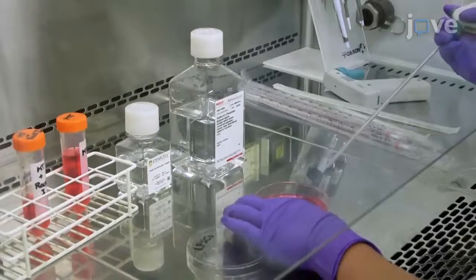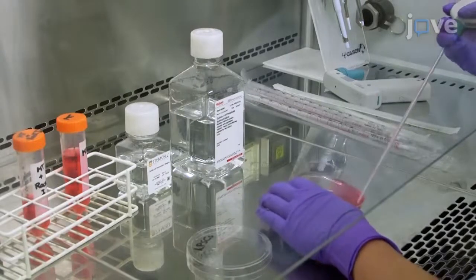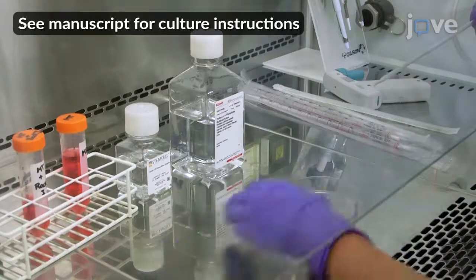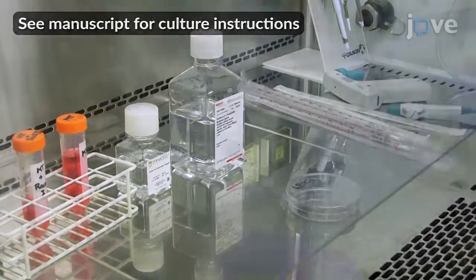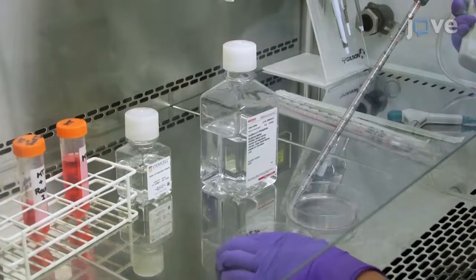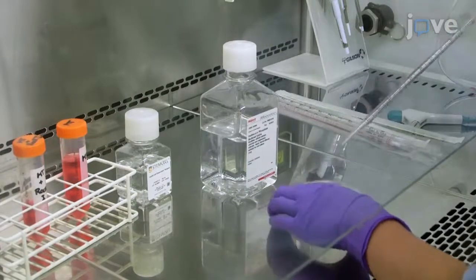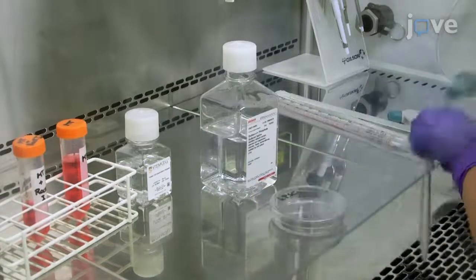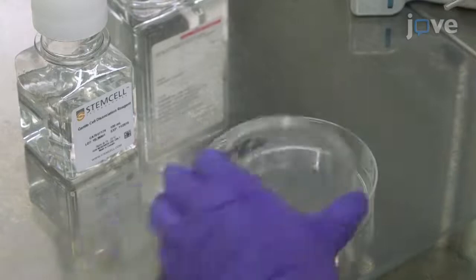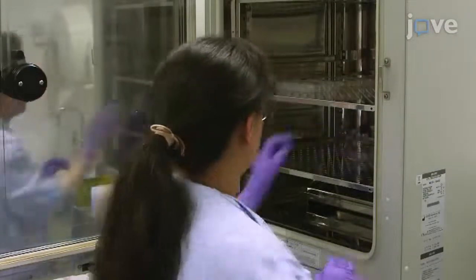To prepare the cell suspension, start by aspirating the medium from an undifferentiated culture of human pluripotent stem cells, or HPSCs. Rinse the cells by adding 5 milliliters of room temperature DPBS, calcium or magnesium free, and then remove the buffer. Add 5 milliliters of cell dissociation reagent to the cells and incubate at 37 degrees Celsius for 6 to 8 minutes.